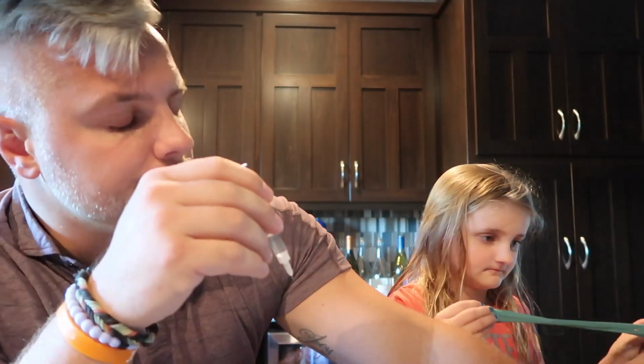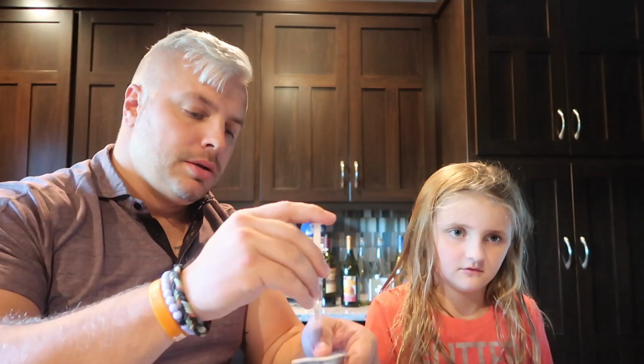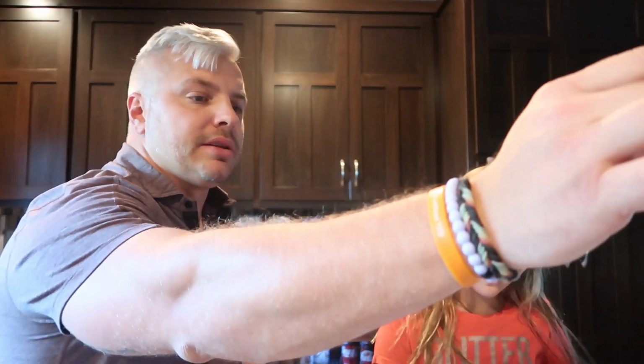Yeah, we'll see. Did you start a new pod? We probably could use it like two more times. So the nice thing is Nevaeh already took her pod off because it fell off in the pool, so we don't have to do that. Gray, you can go put it downstairs, please. Thank you. Next, let's get that primed. Austin, can you toss this stuff for me, please? There we go. Priming. Hey, Austin, can you stick that back in the fridge for me, please?